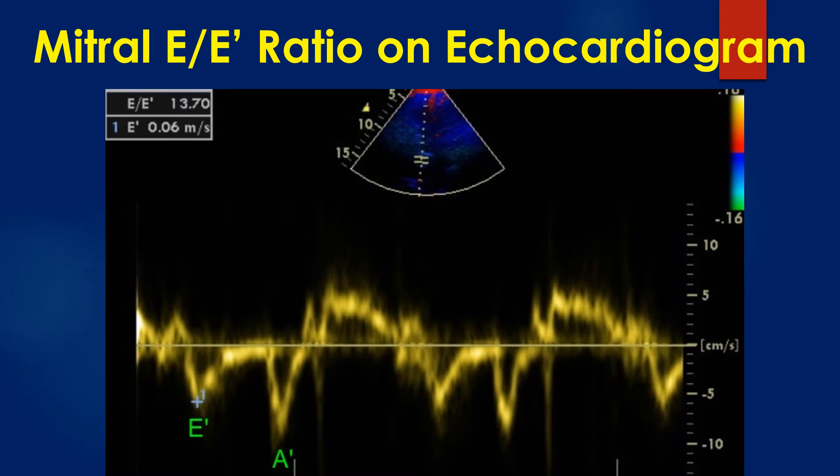Tissue Doppler echocardiography showing measurement of mitral E by E prime ratio for assessment of diastolic dysfunction. Initially, the mitral E wave is measured and stored as given in the image.